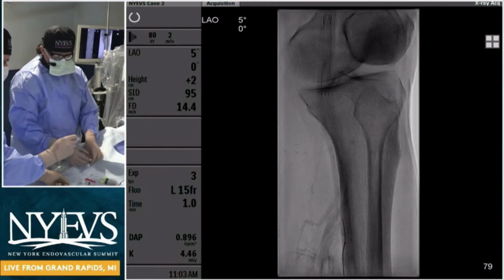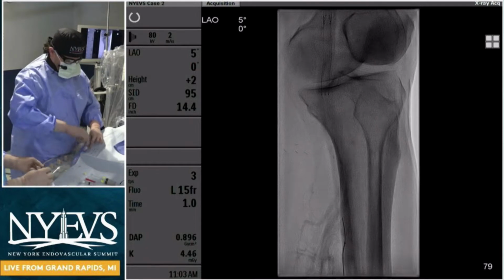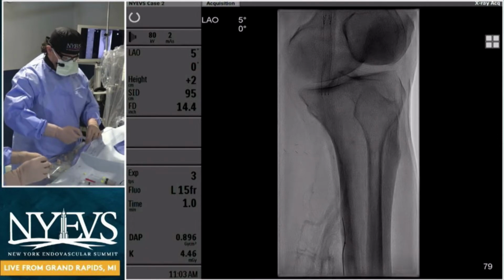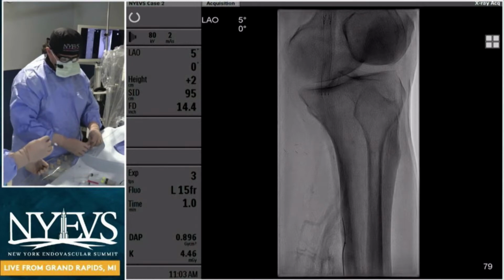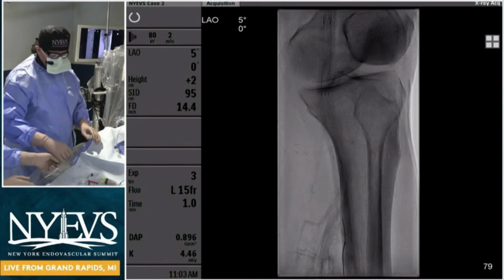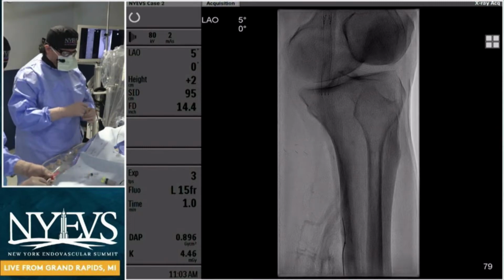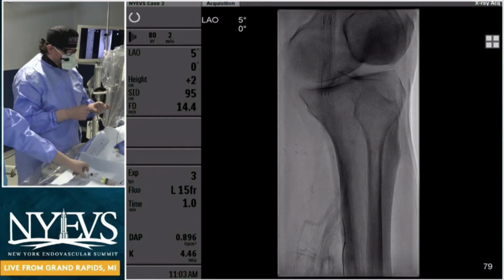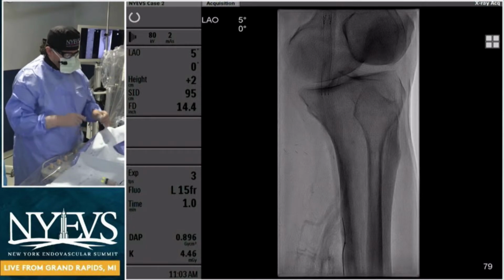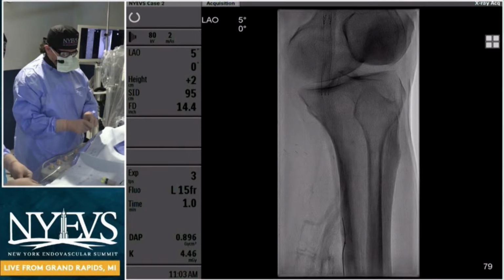Okay. Fadi, just one question to you. What's your anticoagulation when you come from below? I know you told us your cocktail stuff, but anticoagulation-wise, are you a heparin person or do you do something more exotic like bivalirudin? No, actually, nothing fancy. We use heparin. We shoot for an ACT between 220 and 250. I actually don't go above 250, even for tibial interventions. And we check ACTs obviously like everybody else in our lab here.